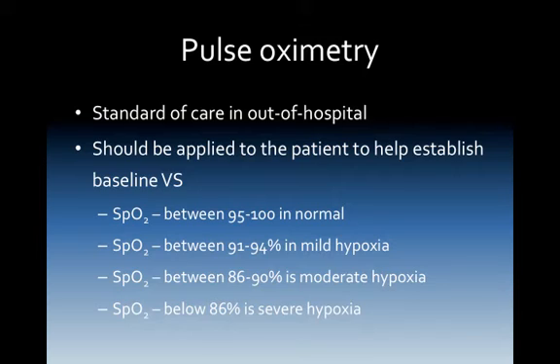We should be careful of low perfusion states. CO poisoning will give us aberrant signs on this as well. CO poisoning could give us an SpO2 of 100, but I will assure you at the cellular level, they don't have 100%. Pitfalls of this: cold fingers, poor perfusion. So just be aware of that as we're looking at the pulse oximetry. The only thing that it sees is how much the red blood cell is loaded with oxygen. Now, if the person is anemic, this could be a pitfall as well. They could have two red blood cells, but they're loaded at 100%.